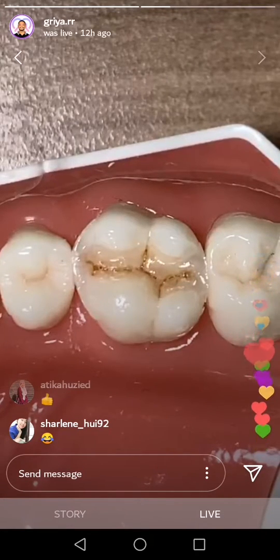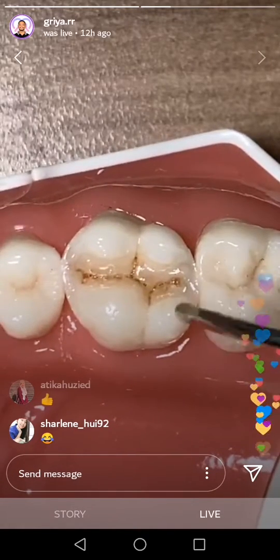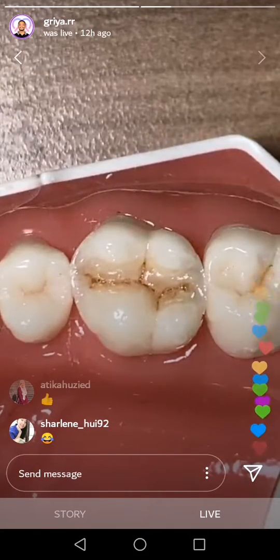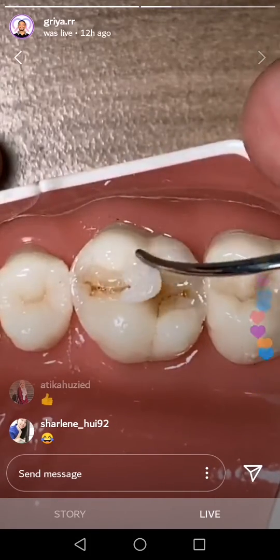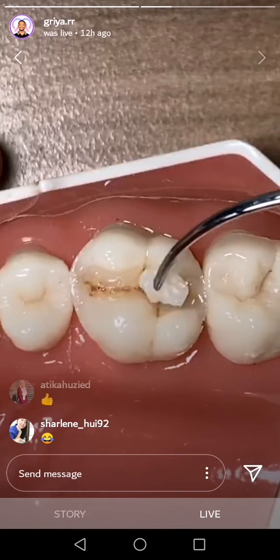Okay, now let's continue these cusps. After this, I create this one. Why I love diagonal like this. Oops.